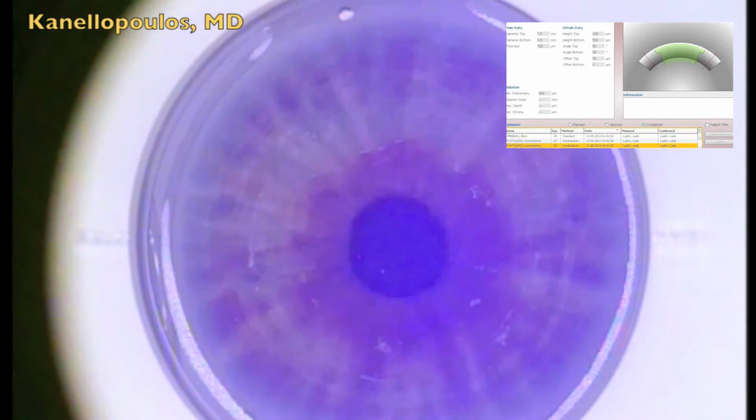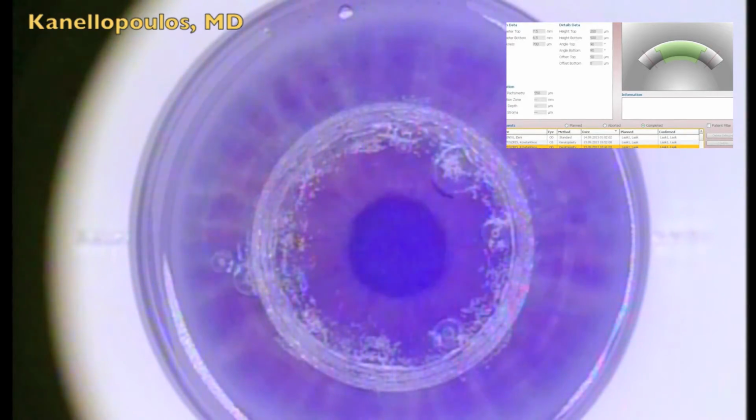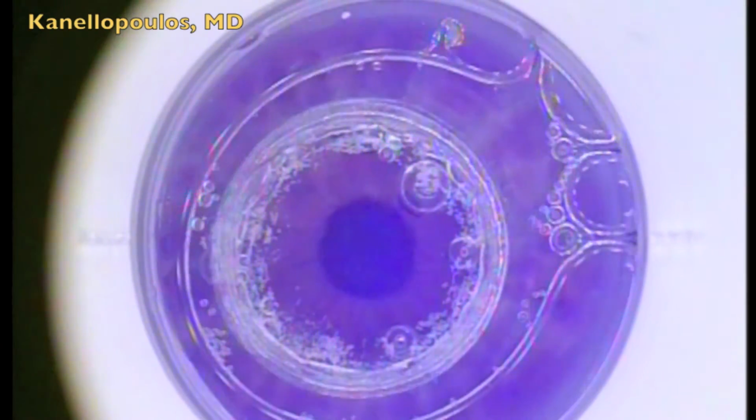You will see it starts from the endothelial side up, so there's gas in the anterior chamber, then it incises, scores the Descemet's membrane, and goes into the posterior stroma. Then it will create the step that you can see in the top right treatment plan, and then come up and surface just short of the epithelial layer. So the trephination of the host is completed.